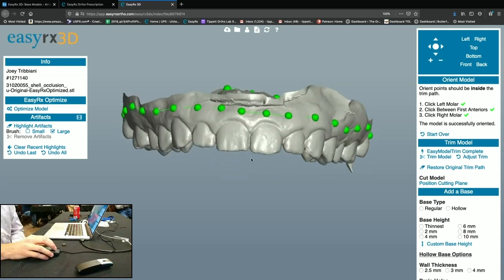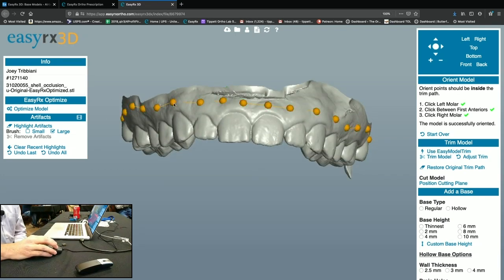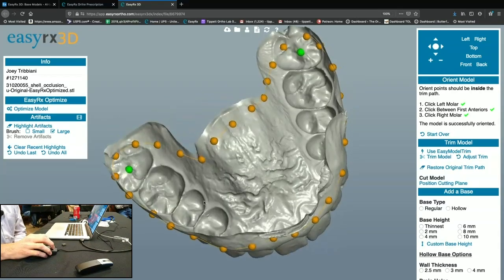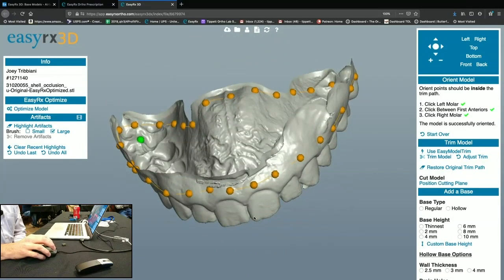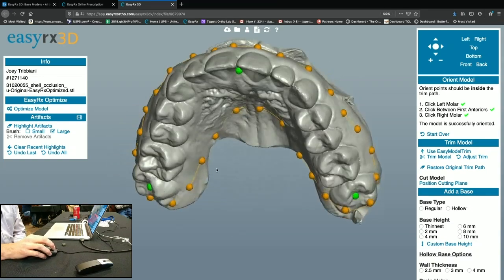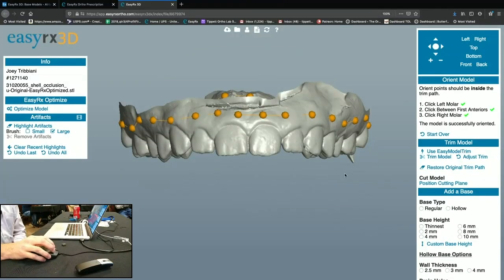Now, you can always go back and edit. If you see something that's too tall, you can look at it here. If you want part of the palette, if you make horseshoe retainers, you can pull this and get rid of some of the height, which will save you some resin and some print layers. And then once you're all done, cross your fingers, you trim it.